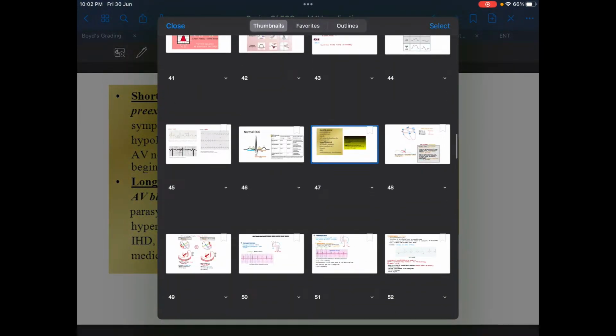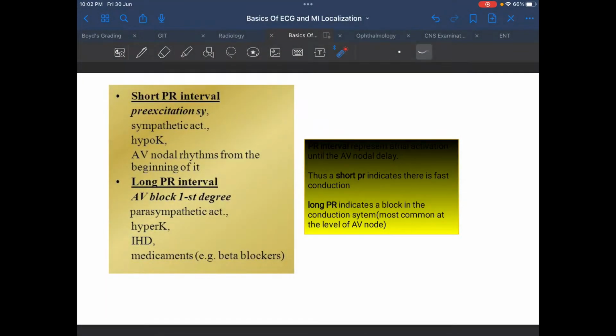So we're going to continue the rest of the session. We have covered about 50 slides over here. In the next session, we're going to conclude. I think today took a little more time because we were delving into physiology as well. What have we basically done today regarding the P wave? We have discussed the basic orientation of the different cardiac axes and vectors. The second thing we did today was about lead placement, whether it be the generation of your unipolar chest leads, unipolar augmented limb leads, as well as your bipolar limb leads. And we also studied how they are augmented, by how much, and what the arrangements are in the frontal plane or in the horizontal plane.